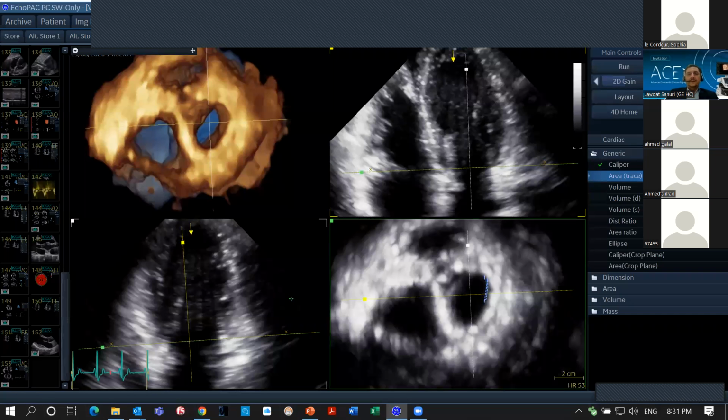So here's generics. I'm sorry, my mouse is really acting weird. I'm not even able to make this tracing properly. But because I have this flexi slice, right? Yes. I'm just trying to use flexi slice just to measure this image. Sorry, again, my mouse is just going all over the place.